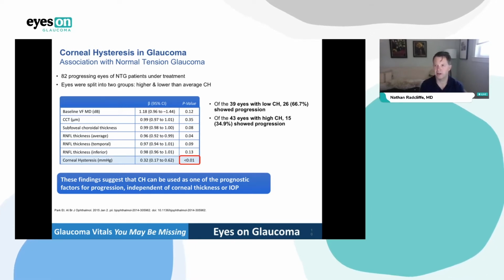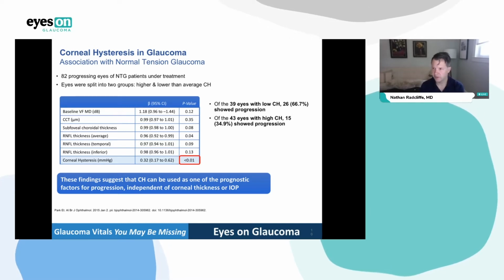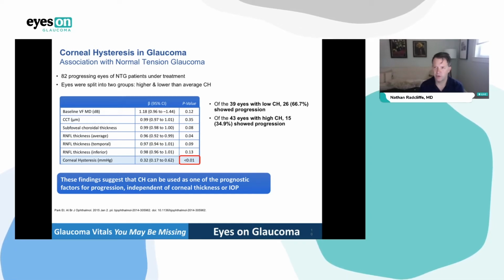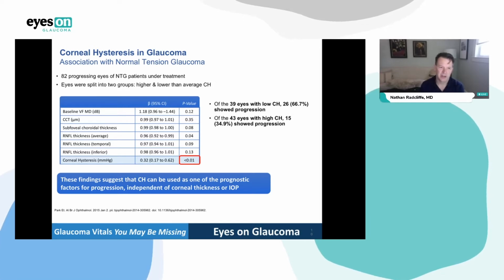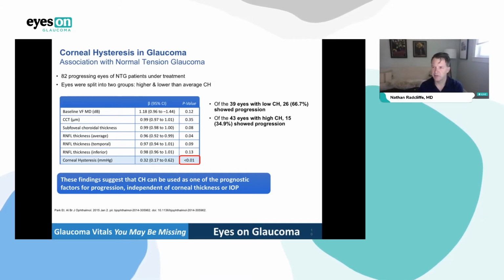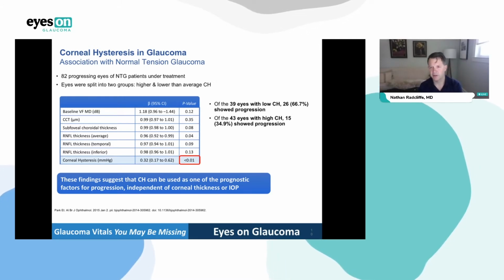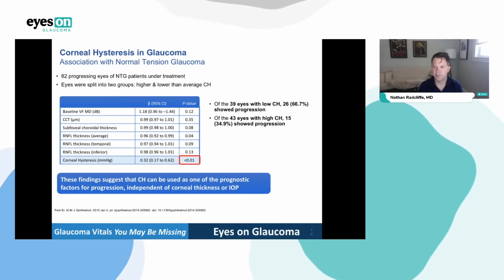So if you take one thing away from this talk, it is that people with a low hysteresis are more likely to have glaucoma. So if you have a pool of glaucoma suspects and hysteresis is low in some of them, they're more likely to develop glaucoma. And if you have normal tension glaucoma or just regular run-of-the-mill glaucoma, a low hysteresis is a risk factor for progressing. And just to get a little bit ahead of myself, just like corneal thickness, it's probably both a risk factor because the pressure is really higher than we measure, but also independently a risk factor regardless of the pressure. So low hysteresis, you're more likely to progress. In fact, in the low hysteresis group 2/3 progress compared to only 1/3 of those with a higher hysteresis.